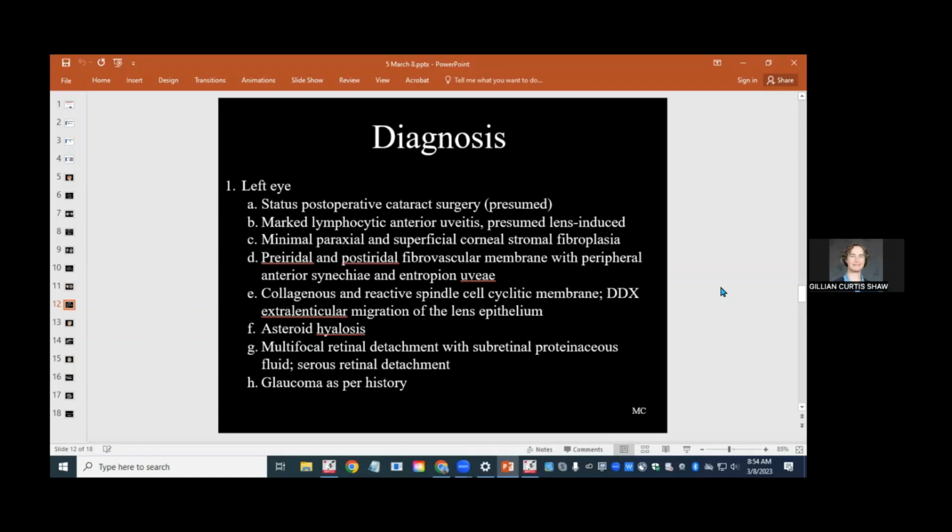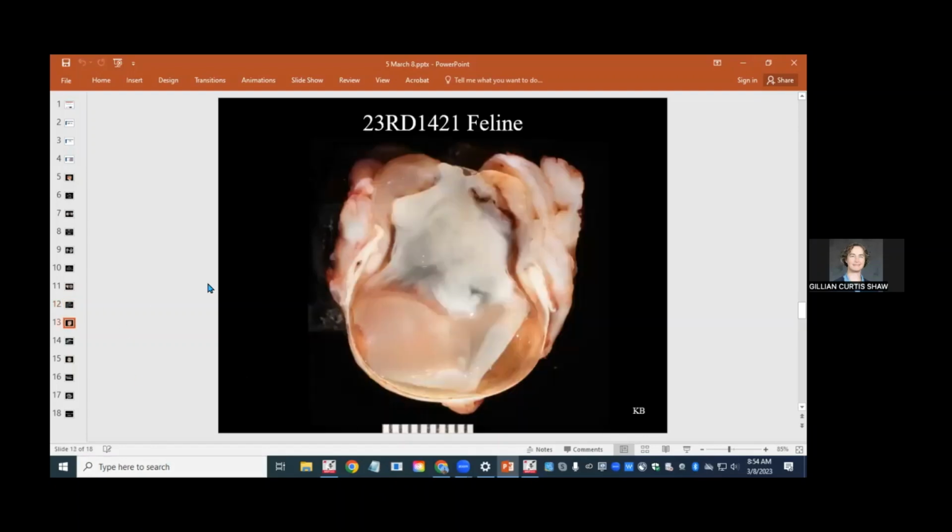All right, we've got 5 minutes left. I will be swift. We'll do only one of these, but that's all right. This was a 14-year-old Siamese cat mix. They submitted to us both the right eye and a mass from the left lower eyelid.